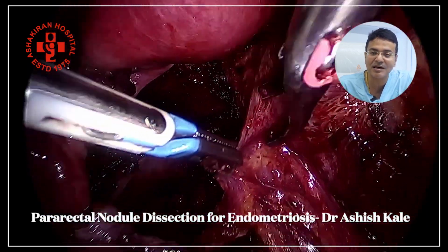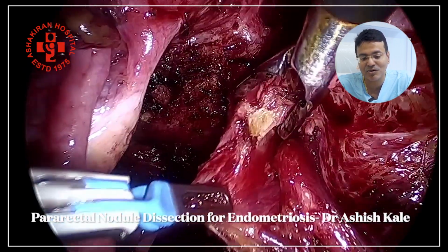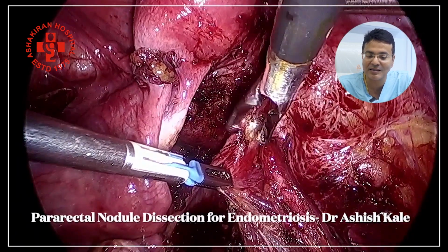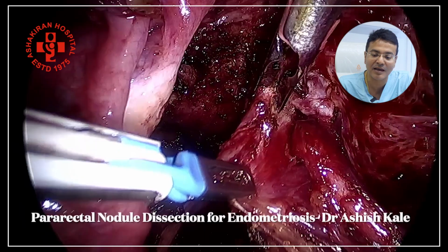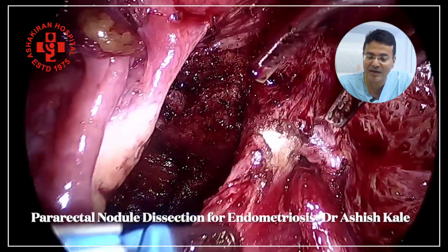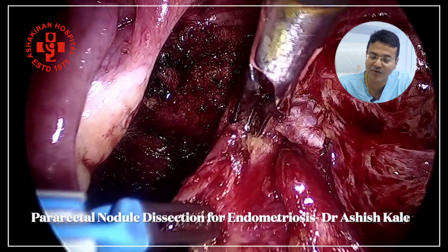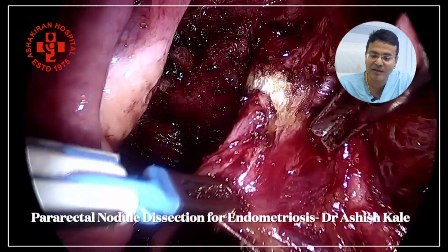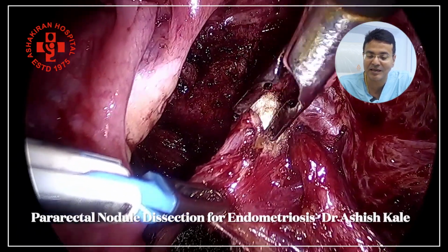You can see this particular area where the broad ligament or the parametrium is a thick structure, and here the ureteric tunnel dissection is already done. You can see the ureter is going through the ureteric tunnel and it is safeguarded. Herein, our instruments are just simple instruments. We are using a bipolar shearer and the bipolar for the traction. The traction and counter traction play the important role. The ureter is safeguarded, and you can observe the ureteric tunnel dissection is done.